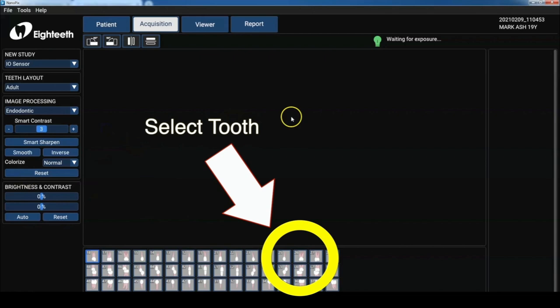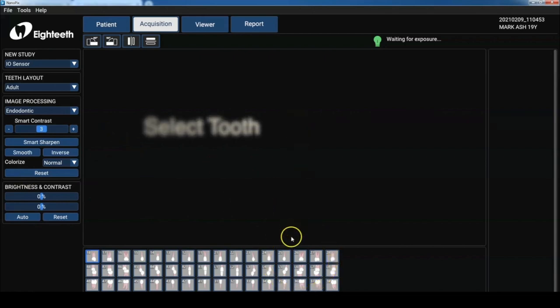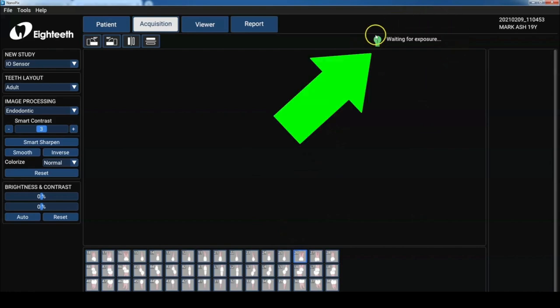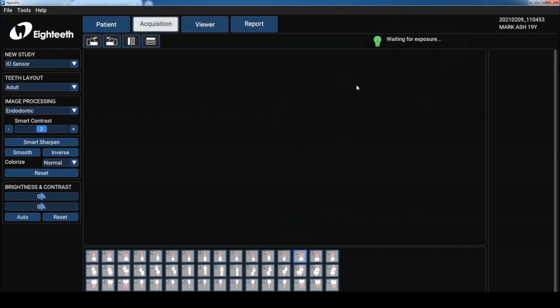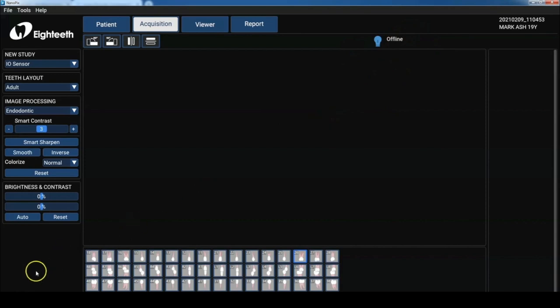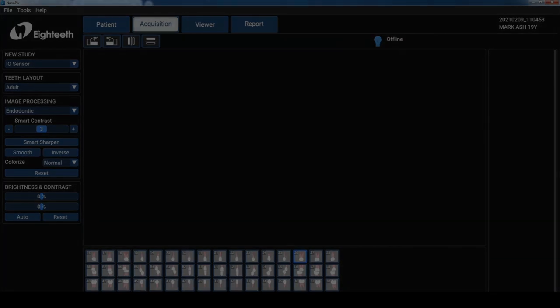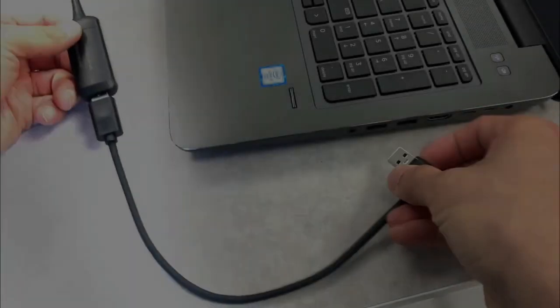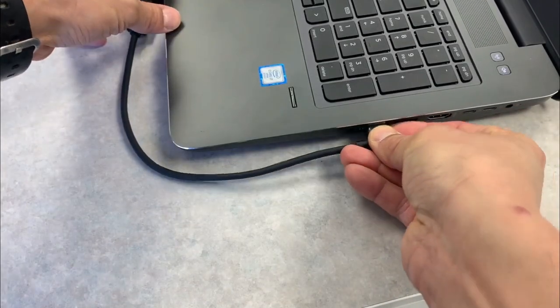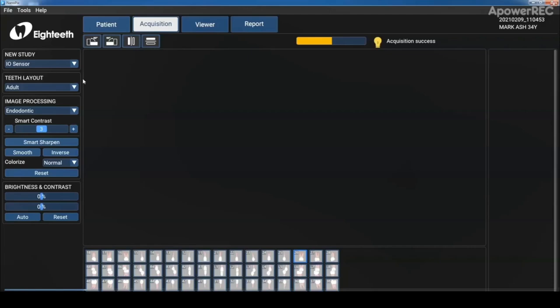Now we're going to take a radiograph on me, tooth number two six. And you know the beauty of this program is that it's always ready for exposure. So you can see here it's waiting and ready. But if you see the blue, it means that your sensor is disconnected and you need to reconnect it.